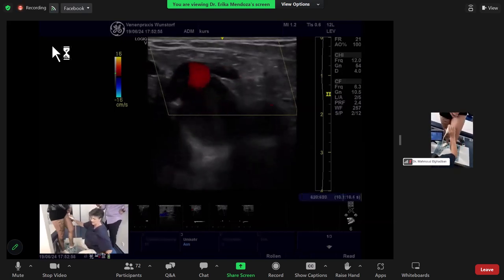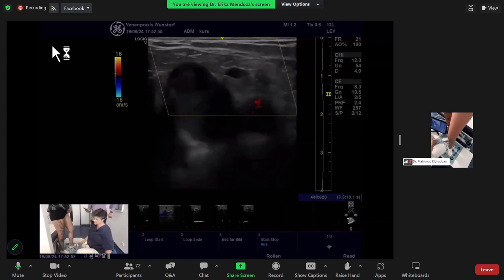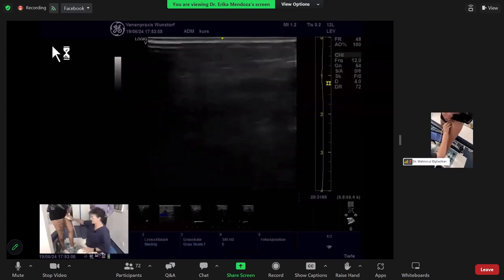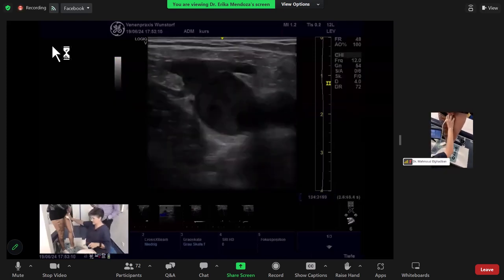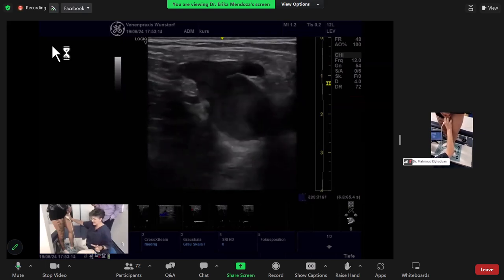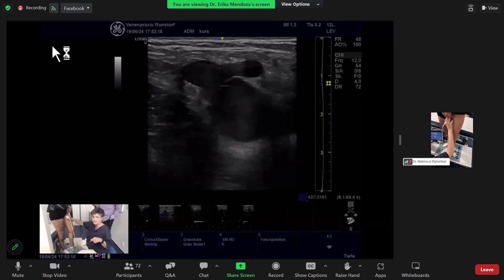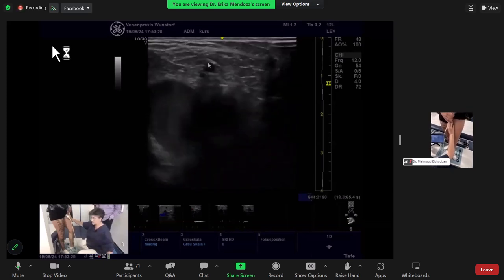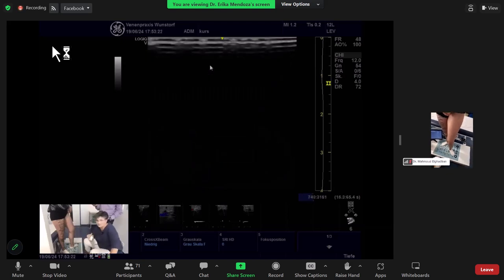From your experience, when you treat these two tributaries, will the big great saphenous vein that we see here shrink in size and become normal again? In this case, where the terminal valve is semi-competent, I would only treat the tributary. If I could foam just this one, this would be effective only if the terminal valve is really competent.